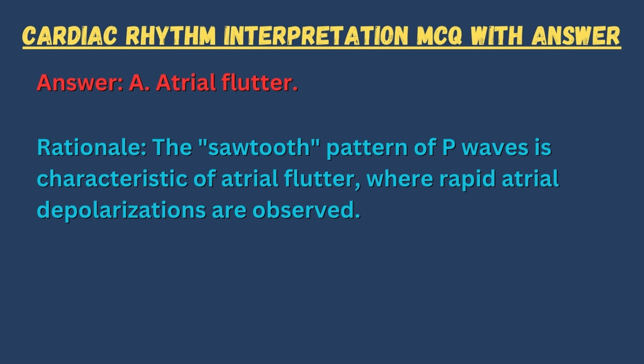Answer. A. Atrial flutter. Rationale. The sawtooth pattern of P waves is characteristic of atrial flutter, where rapid atrial depolarizations are observed.